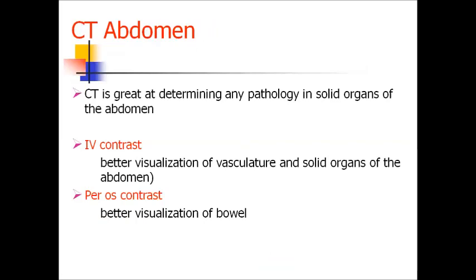CT of the abdomen is great at determining any pathology in solid organs of the abdomen.